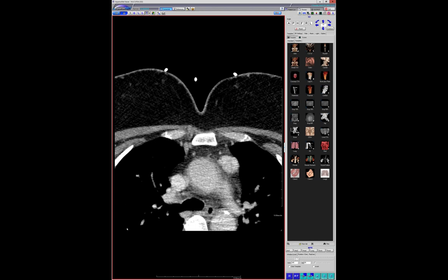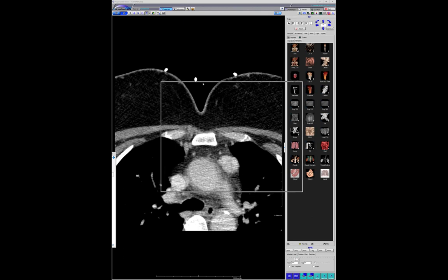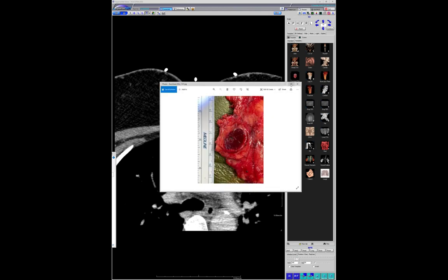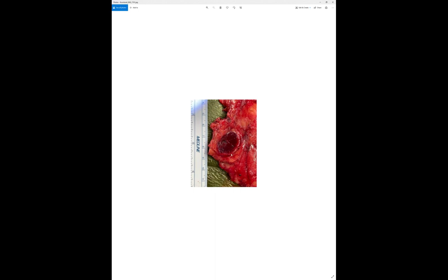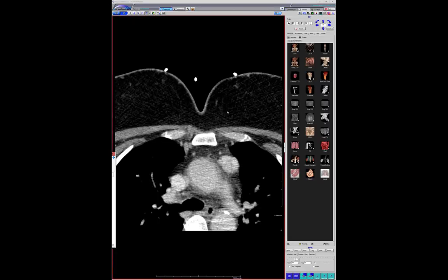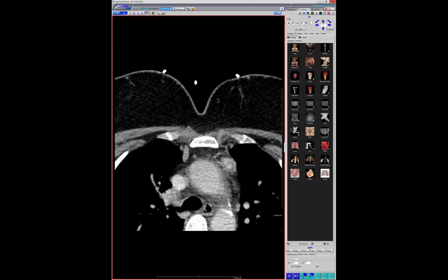Depending on what they look like — this doesn't have anything to suggest thyroid. It doesn't have any low attenuation areas like we see with ectopic goiters. They took this out and this was actually a hemangioma — a pre-vascular hemangioma buried in the anterior mediastinum. It's only the second mediastinal hemangioma I've come across. Relatively rare — always at the bottom of that list. I've seen a lot more Castleman disease than hemangiomas — like six versus two.